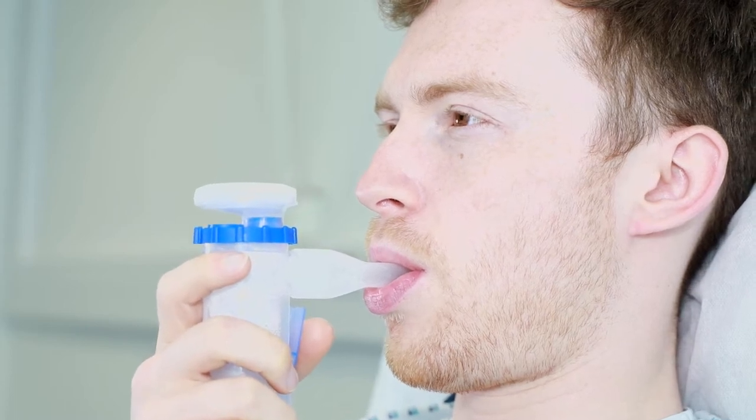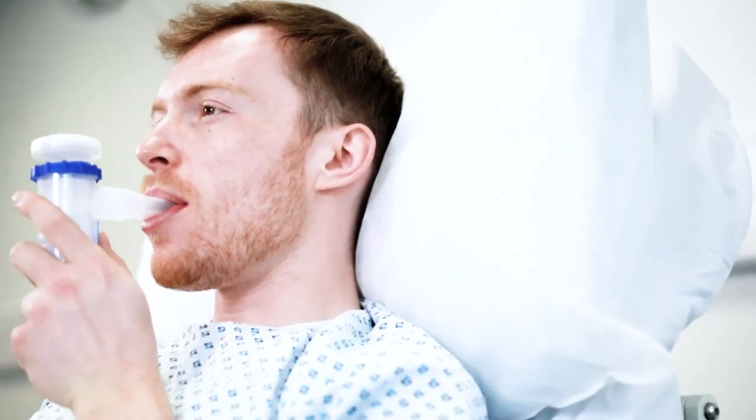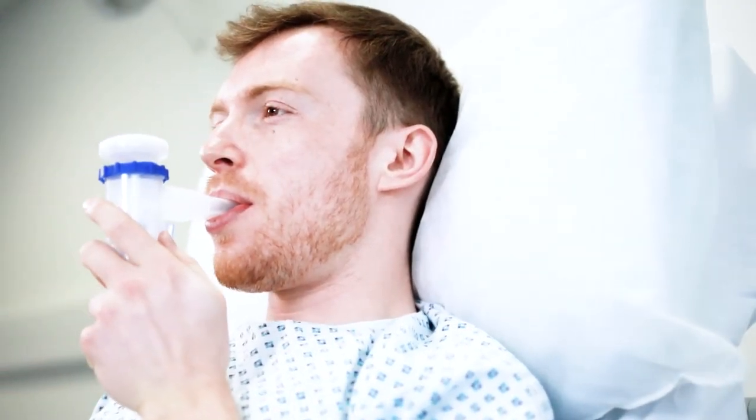Press the trigger and the nebulisation starts immediately. When inhaling, the particles move through the nebuliser to the mouthpiece, allowing for new particles to be nebulised in the bottle very quickly.